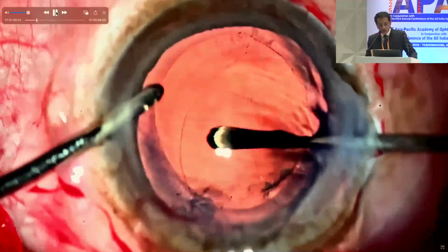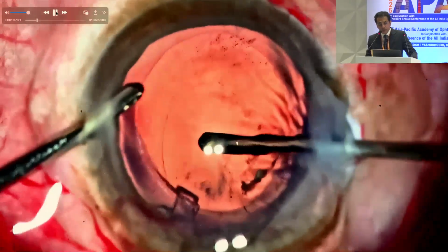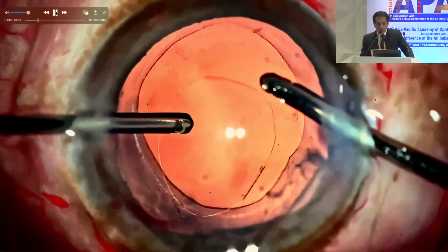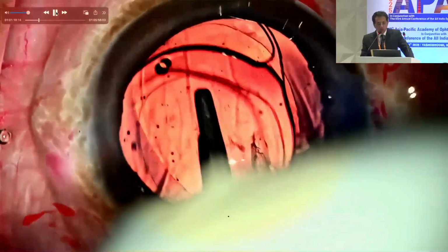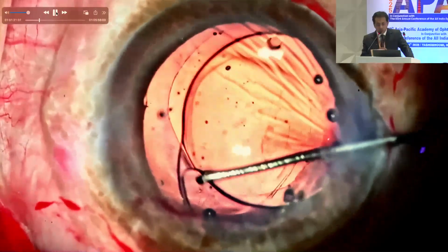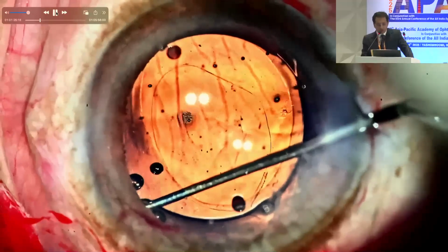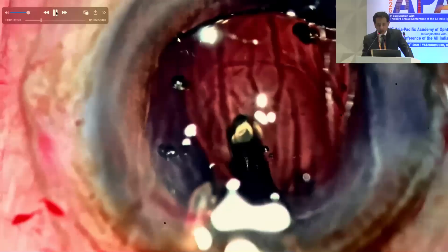The reason we need to perform the rhexis earlier is that it is much easier to do in an eye which is not evacuated of vitreous, because vitreous gives us the support. If the eye has become soft, it becomes a little bit tricky to perform the rhexis. And when you do a posterior capsular rhexis, inflating the bag and placing the lens will be safer. Otherwise, we are going to enlarge the rhexis when trying to maneuver the lens into the bag. Because we have a very strong rhexis, you can place the rigid PMMA lens into the bag and still not have an extension of the rhexis.